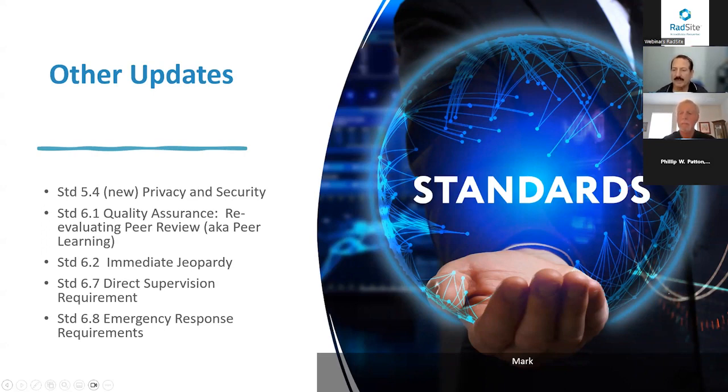I would love to see staff minutes or notes that document discussions these groups are having internally, asking themselves: how about the age of our equipment? How about the field strength? How about determining which types of studies should be done on what equipment?